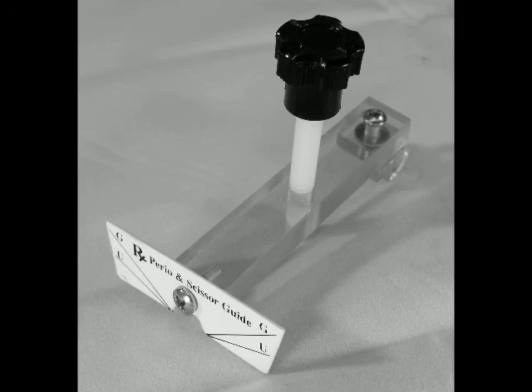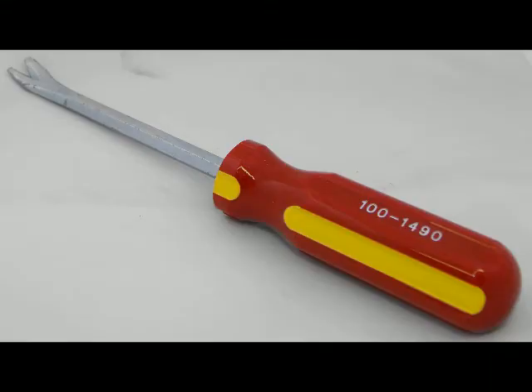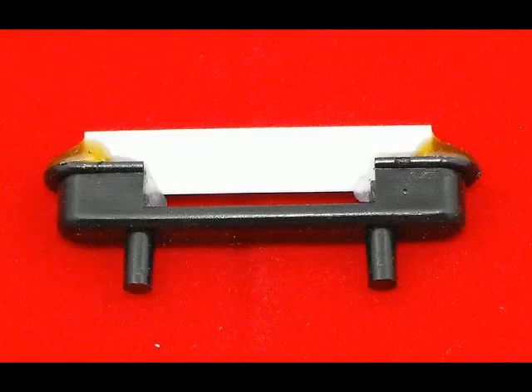the operatory. All of the discs and hones need to stay clean, so we have included an RX hone cleaner with the set. Please follow the directions on this hone cleaner to remove the metal deposits to give you a clean surface for the sharpening of your instruments. We also have included a disc removal tool. Use this tool to keep from delaminating the discs as you remove them from the machine.